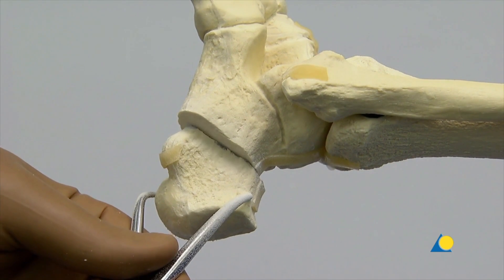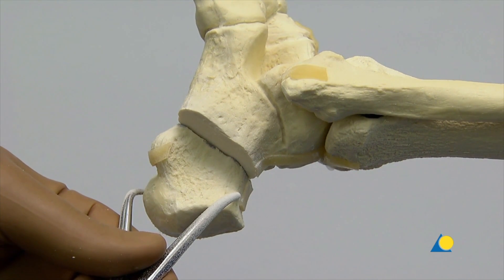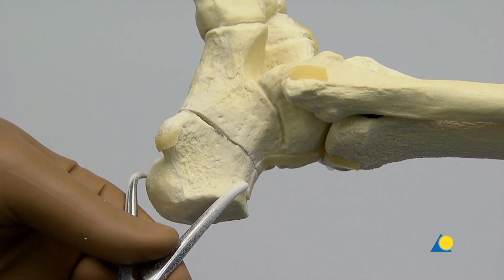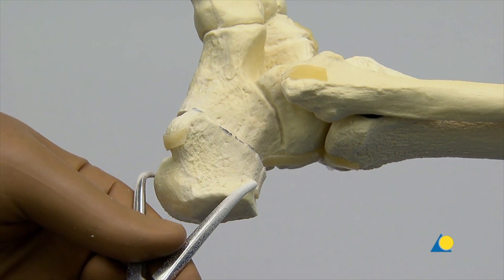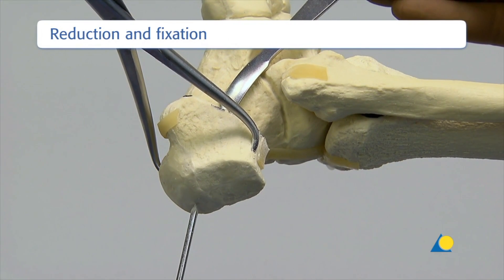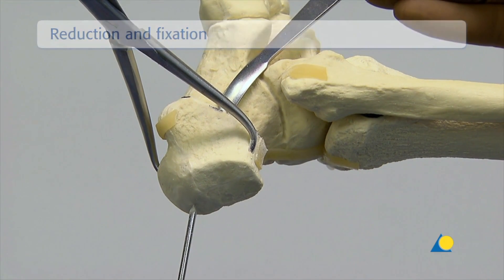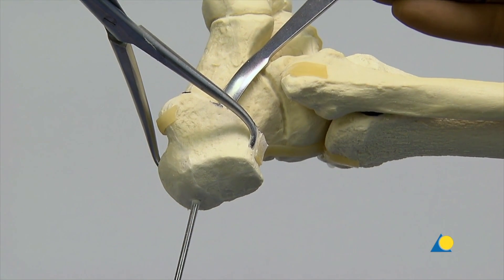The tuber fragment is translated inferomedial to correct a plano-valgus deformity. For a correction of a cavo-varus deformity, the tuber fragment is translated superolateral. Once the intended position of the tuber is achieved, it is provisionally maintained by placing an osteotome or Hohmann retractor within the osteotomy.